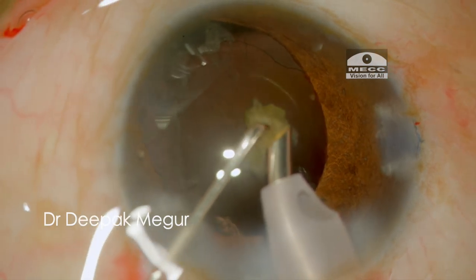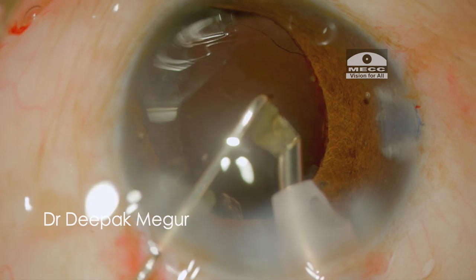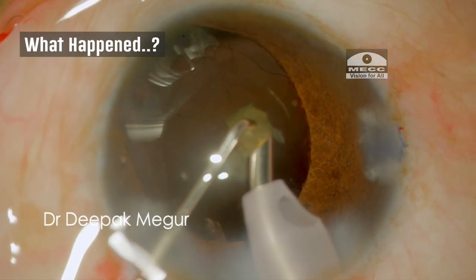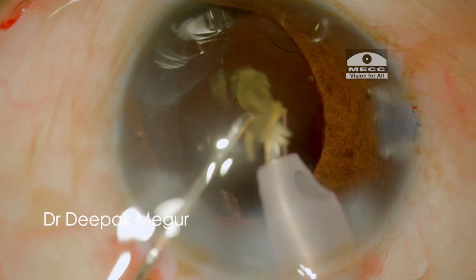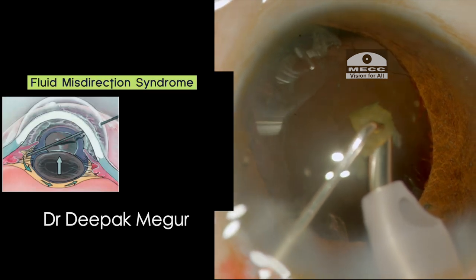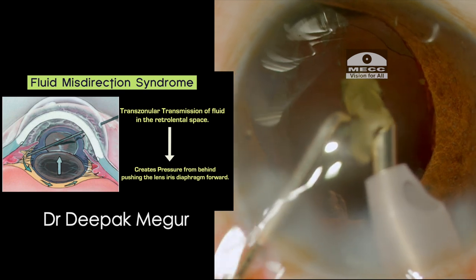At this moment I get the feeling that something is not right, and I come out — and I was right. A small round punched-out hole in the posterior capsule is staring at me. The taut posterior capsule, which was being pushed anteriorly, got caught in the phaco probe resulting in this circular tear. This was happening because the irrigating fluid was traversing across the zonules through the coloboma region and going into the space behind the posterior capsule into the Berger space, pushing the PC forward. This was the classical intraoperative fluid misdirection syndrome, which is to be expected in eyes with colobomas.